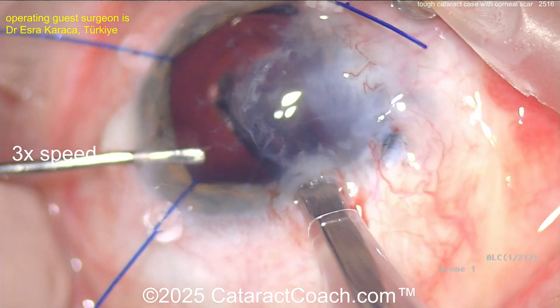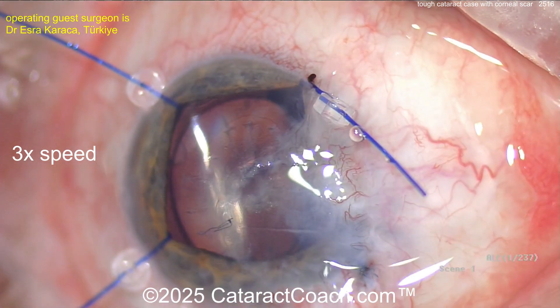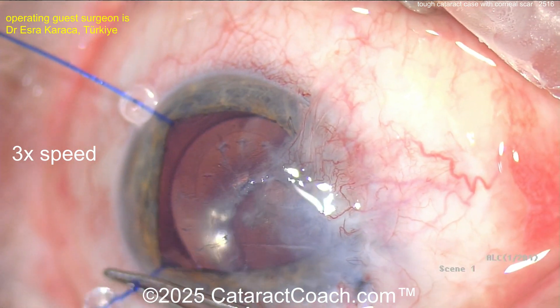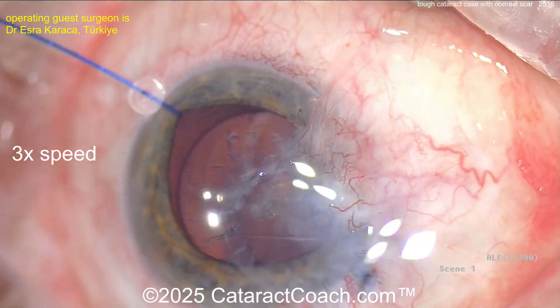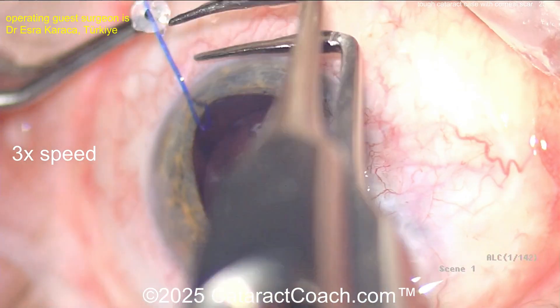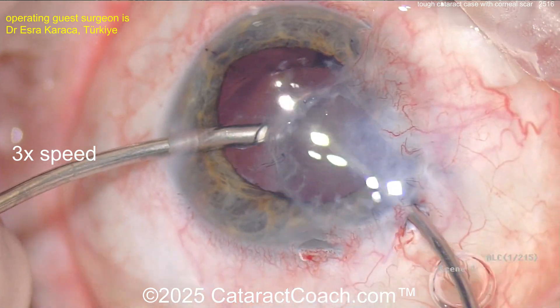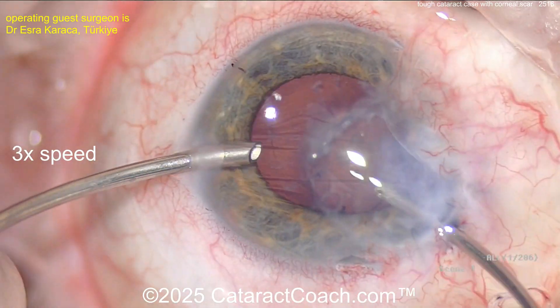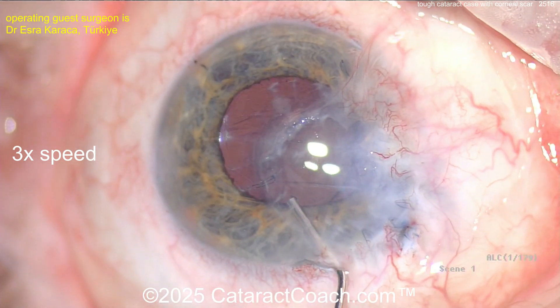Putting the IOL into the capsular bag — a single-piece monofocal acrylic — that looks pretty good. Now make sure all your incisions are very well sealed at the end, including all four paracenteses for the iris hooks. I probably would not do much more manipulation of the iris. You could do a pupiloplasty, but if you yank that iris out of the nasal corneal perforation site, you're probably going to get a repeat perforation — a hot mess to fix. First, do no harm.